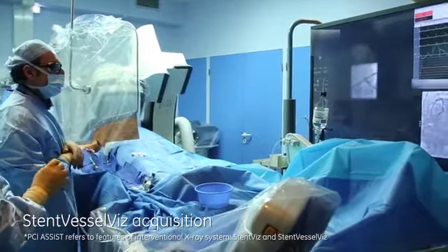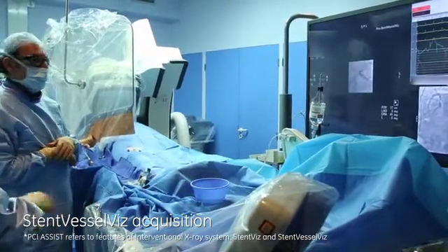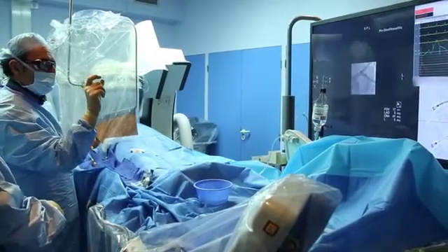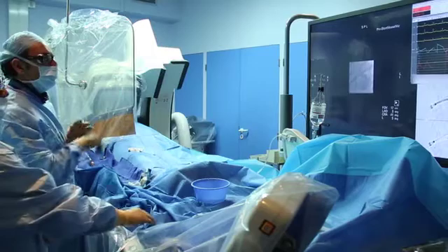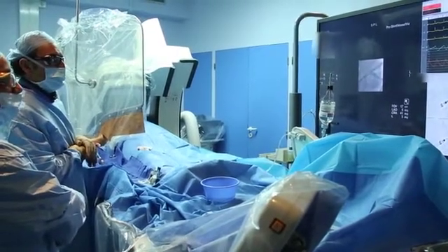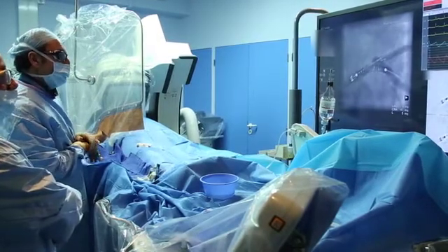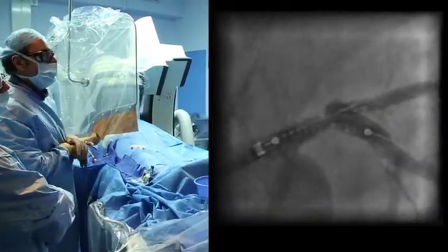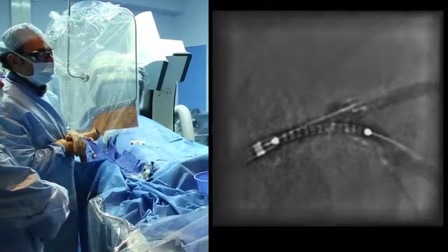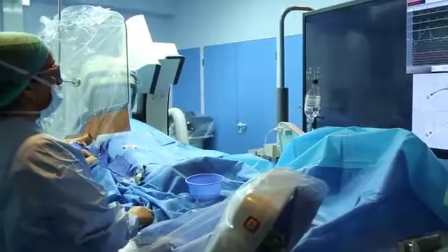The stent vessel Vs is ready. Before two seconds, we inject inside the vessel and we will see the position of the stent clearly, with the position of the ostium and the guiding catheter. As you can see here, it's more precise than with the angio only. You can see the position of the stent.